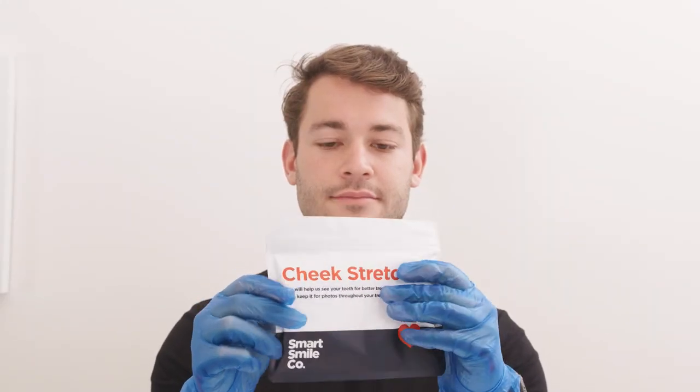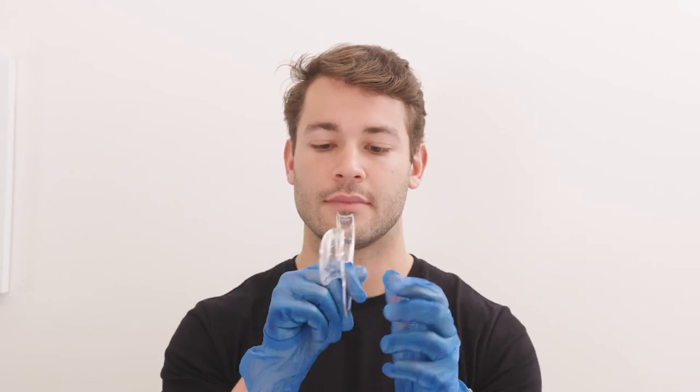The remaining photos are going to get gummy — perhaps even Insta-worthy. You'll need your cheek stretcher located in your kit. To fit it in your mouth, place the bigger tabs on the inside of your cheek with the handle facing down, then push the sides gently together to fit it in your mouth.